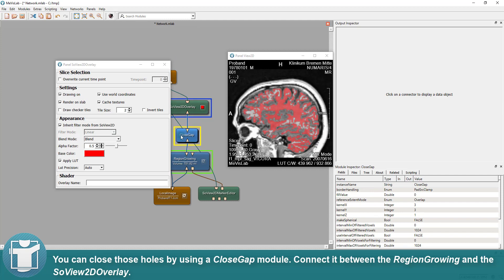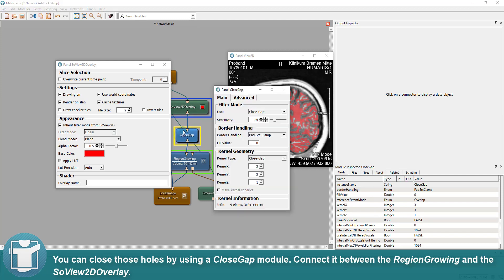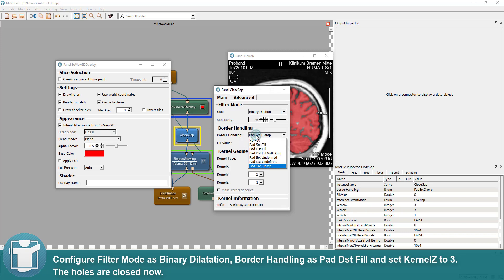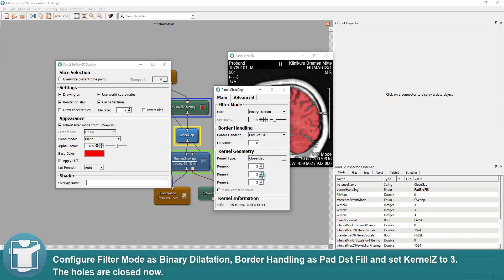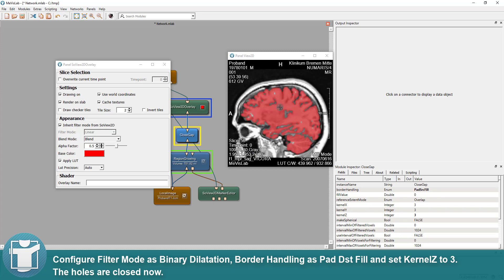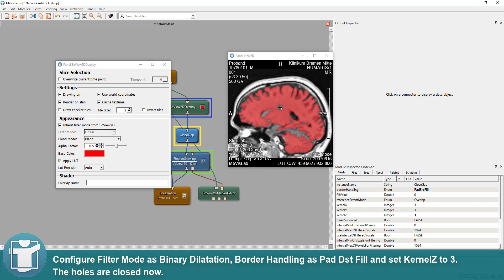Connect it between the region-growing and the SoView2D overlay and configure filter mode as binary dilation, border handling as pad DST fill and set kernel size to 3. The holes are closed now.